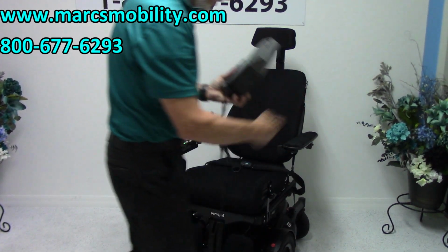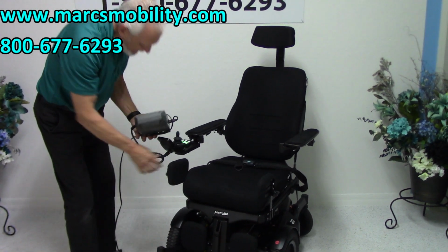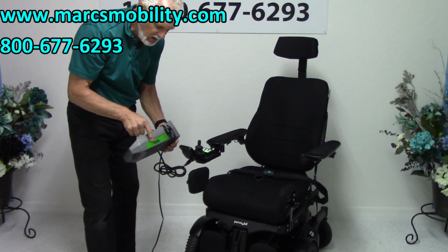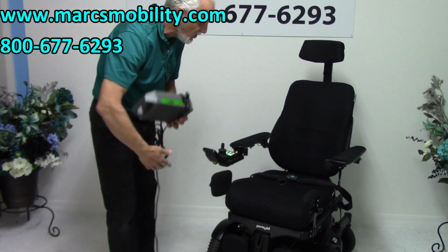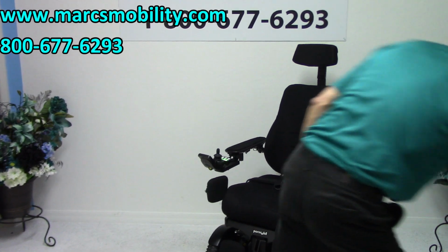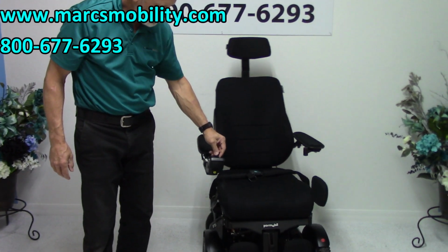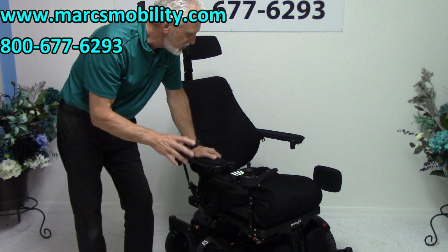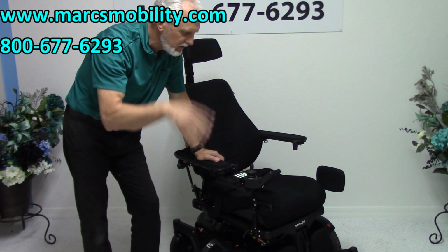When you charge this chair, you take your Permobil charger, you plug it below your joystick, and as soon as the light turns green or full, and this one would be full, 100%, the charger will stop charging. These are smart chargers. They know when to stop charging. So there's 2 batteries in here, and they're gel batteries. They'll give you about 13, 14 miles on the battery charge, but that all depends how many of the functions you use, if you're in the grass, if you're uphill.